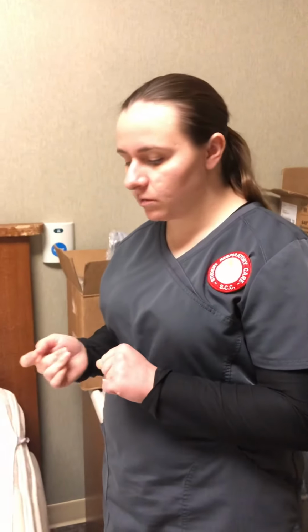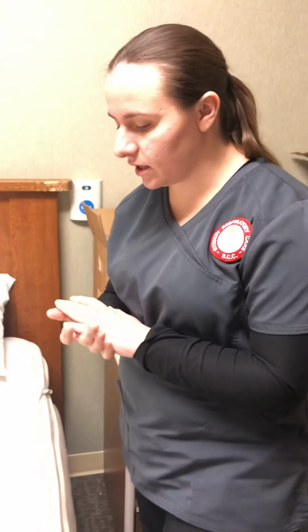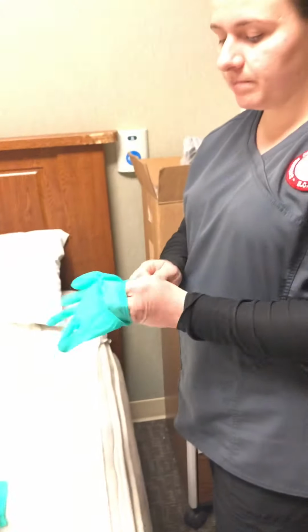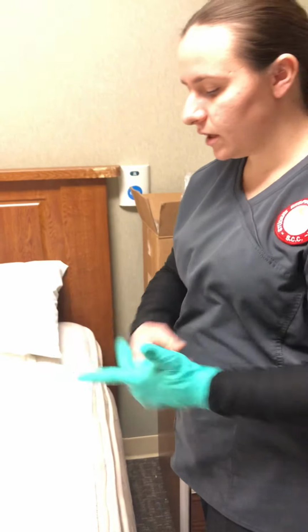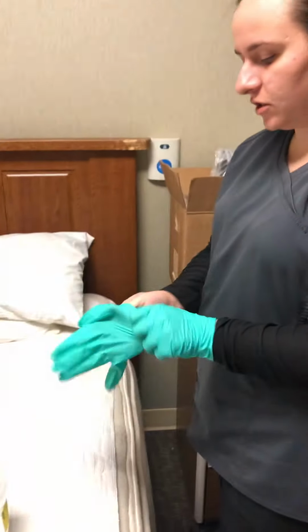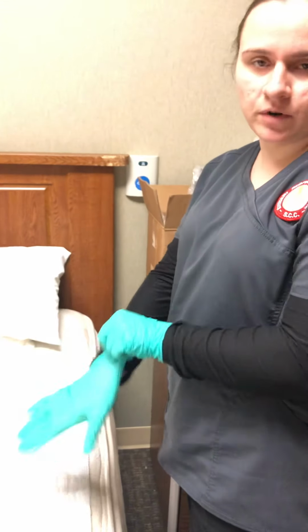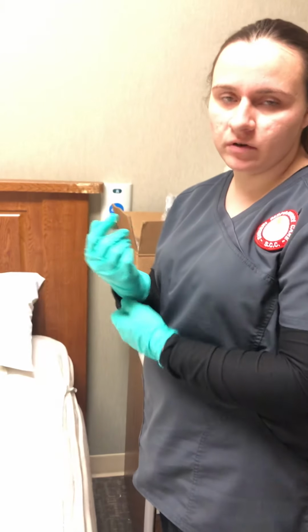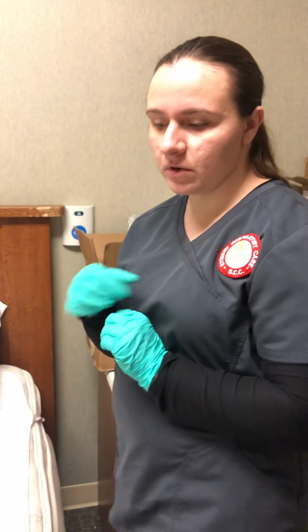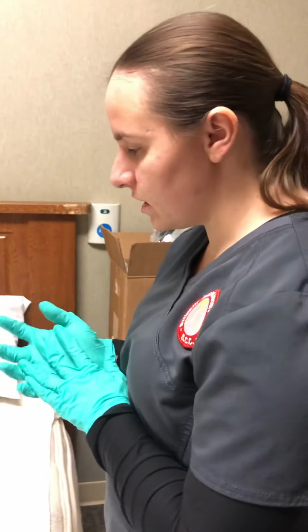So when I am ready, then I will make sure my hands are clean. Once I have everything, I would apply my appropriate PPE. And then when I'm ready, I would check the patient's vital signs. Before I do the trach, before I remove it or anything, I always want to listen to the lung sounds, listen to the trach, around the trach, make sure everything sounds okay before I begin.